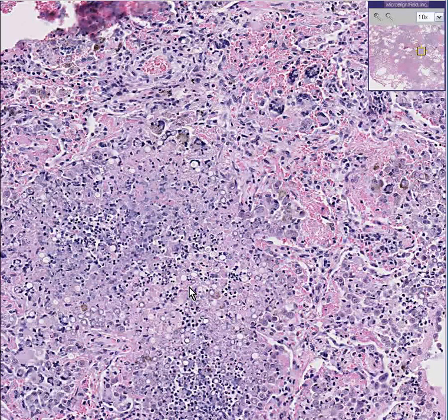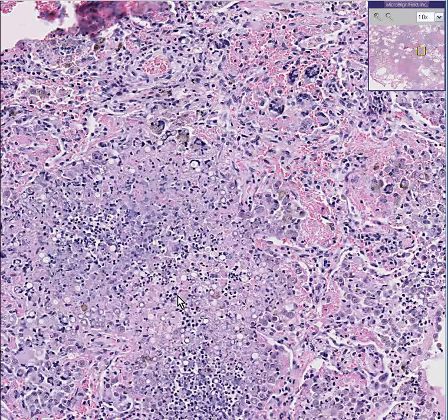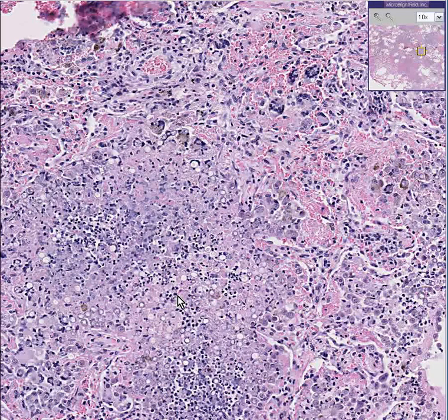This is blastomycosis, and sometimes blastomycosis can be divided into North and South American types. From a morphologic point of view, it's classical granulomas, perhaps some necrosis, and all these little round yeast balls which are so characteristic of blastomycosis. When you think systemic or deep pulmonary fungal infection, think of three things: histoplasmosis, blastomycosis, coccidiomycosis. Of the three, only blastomycosis looks like this.